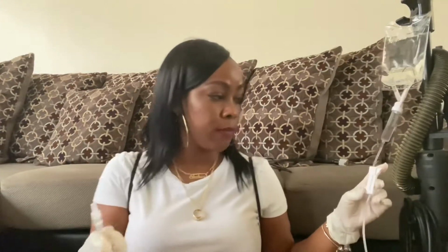Hey. So anyway, this is going to be 30 inches above your patient. So we're going to do that. This right here is already covered, but what I'm going to do is uncover it just a tiny bit, but still keep it covered, because we have to prime the tubing. We want to make sure there are no air bubbles, because that's not safe for your patient. What is it called? An air embolism, I believe. Don't quote me, but I believe that's what it is. So you always want to lock this.